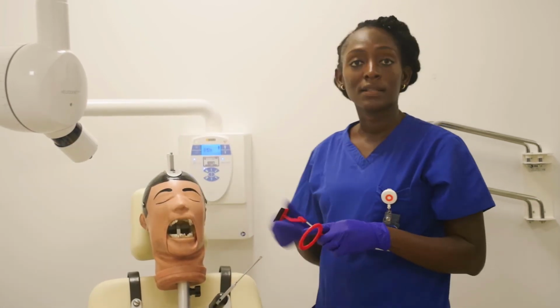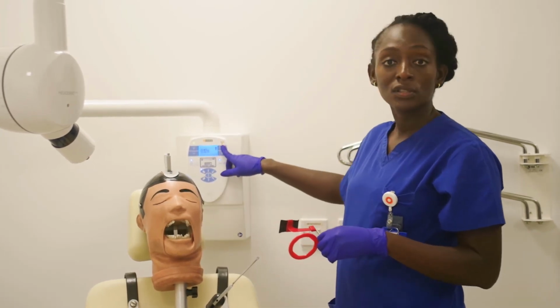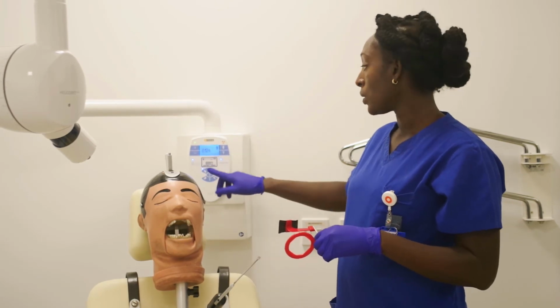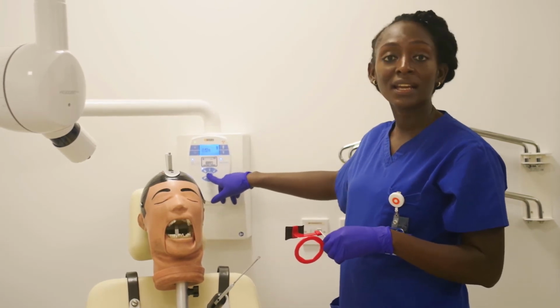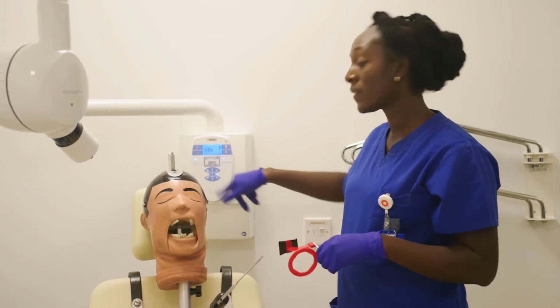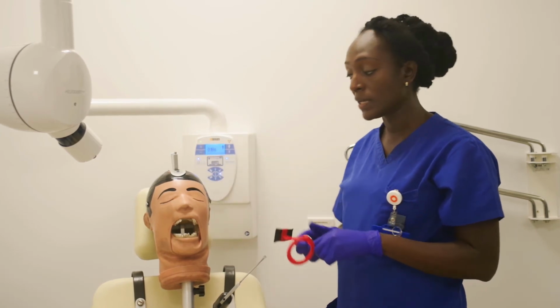So Dexter is an adult patient. I'd want to make sure that the setting is right, so I have it on the adult patient setting. I'd also want to make sure that I have selected the bite wing setting as well. So that's the middle icon, and I've clicked on that.